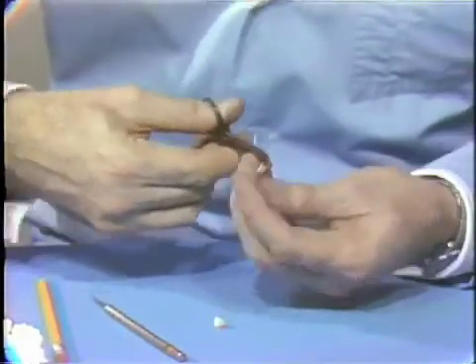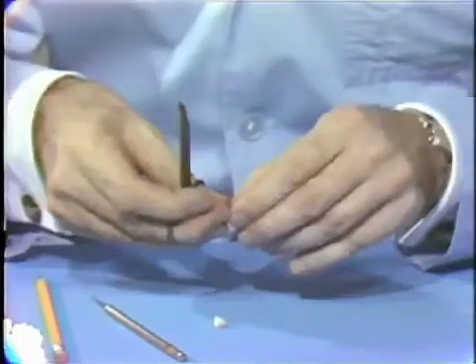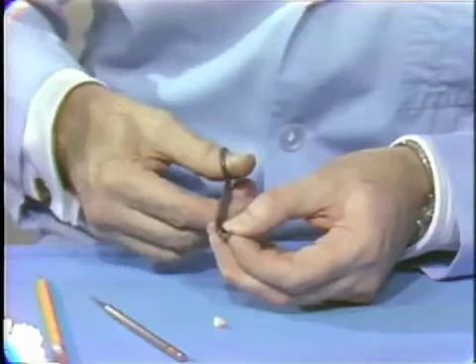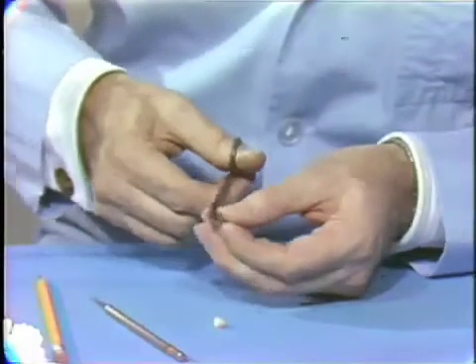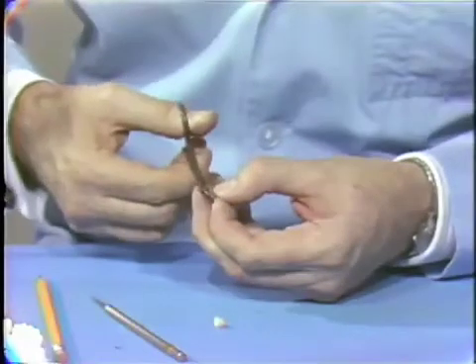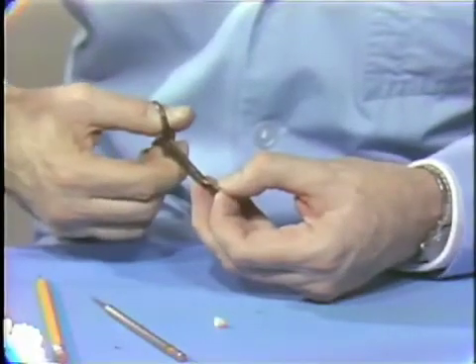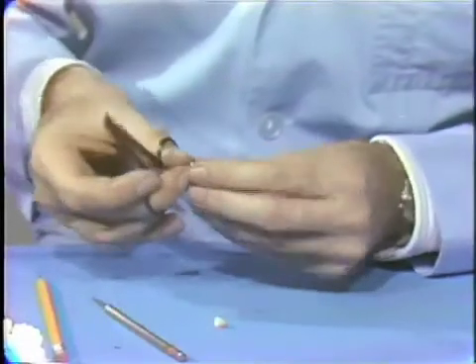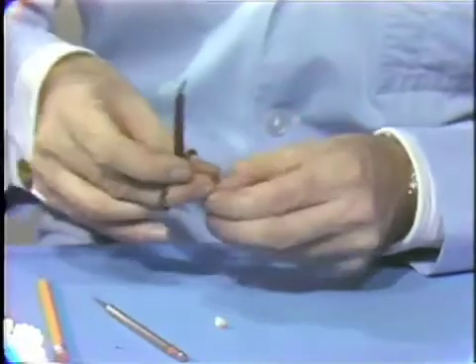It's a little difficult. I'm finding it here in this rather bright light of the TV studio to identify the fine cut line and to keep the thing so that you can also see it satisfactorily. I think you'll find it a little easier to do where you can adjust the lighting more to your particular technique.